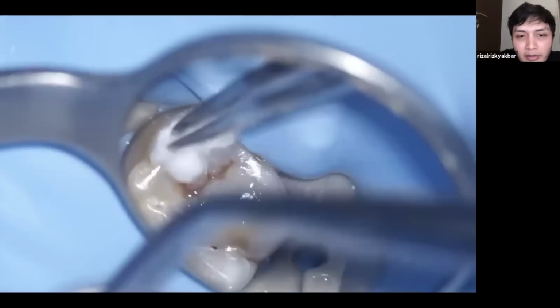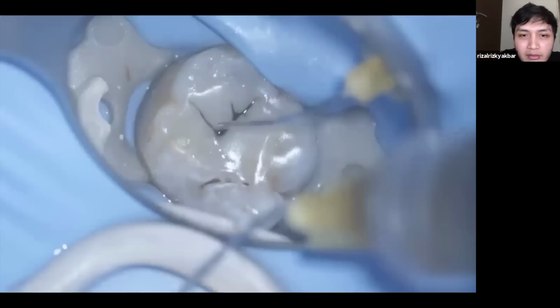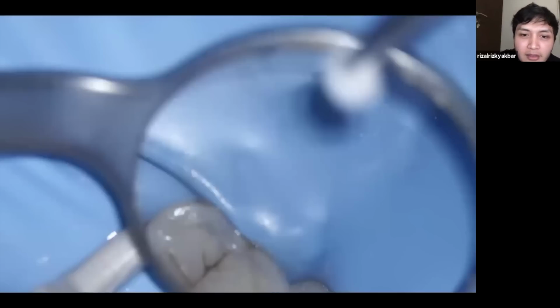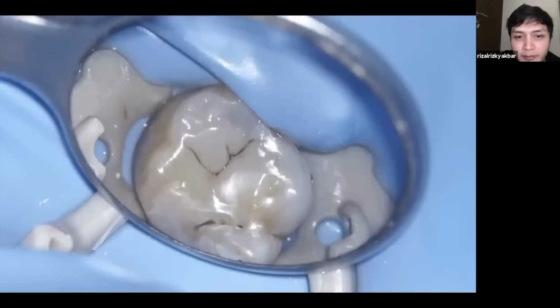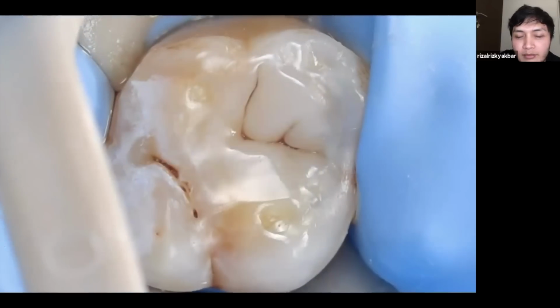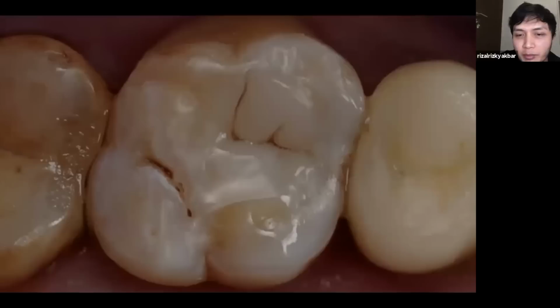Okay, and if you feel that micro brushes are really expensive, you can use the cotton pellet to remove all the excess stain. Yeah, as easy as that. In this case, I use black stain.